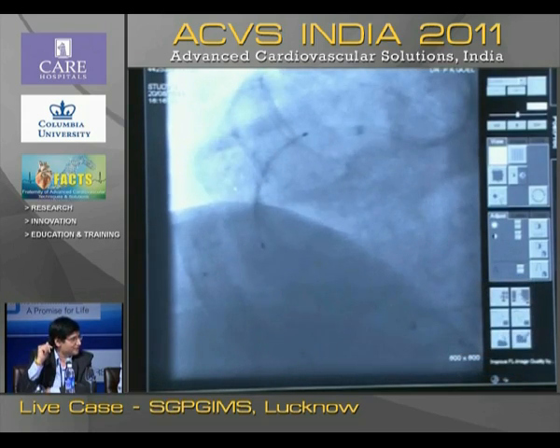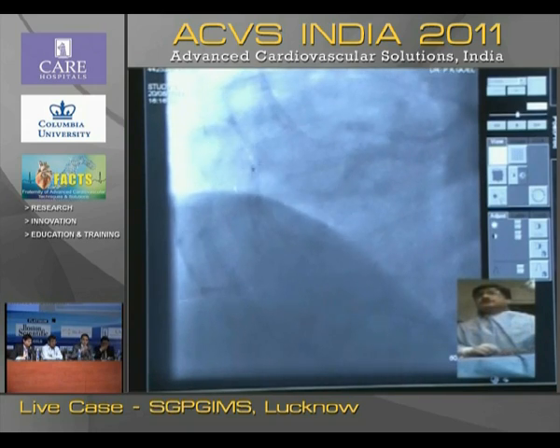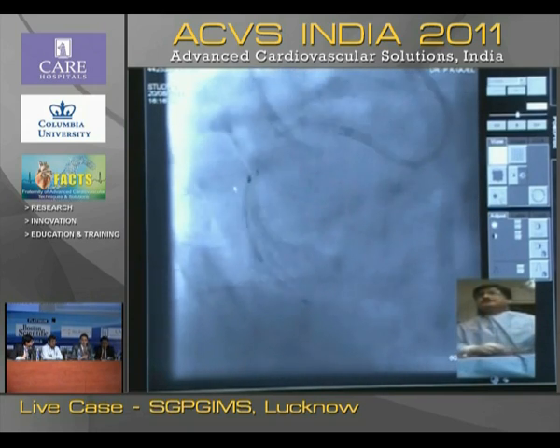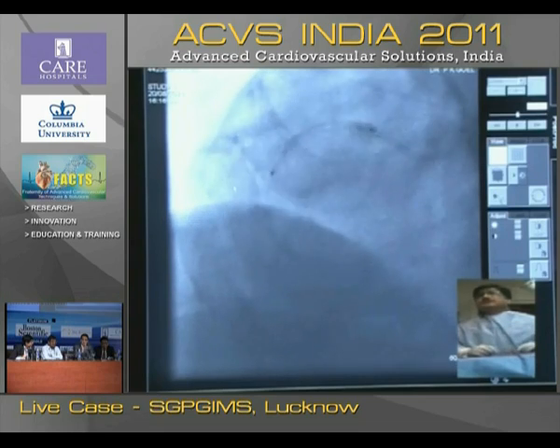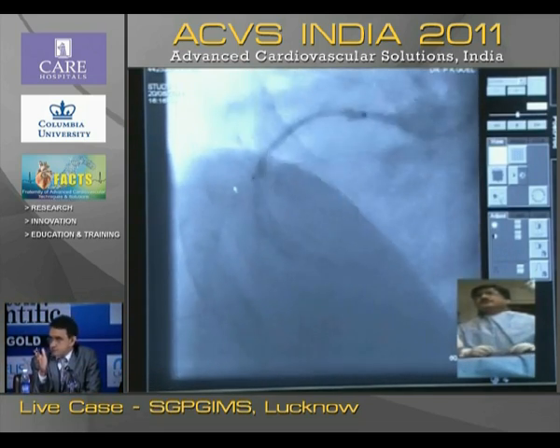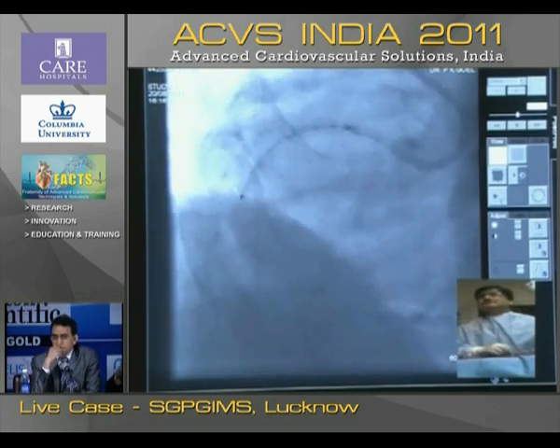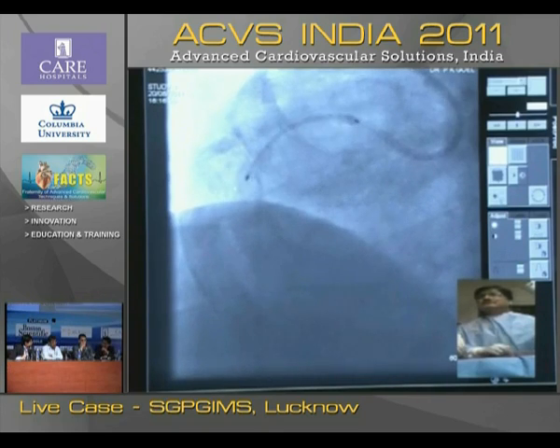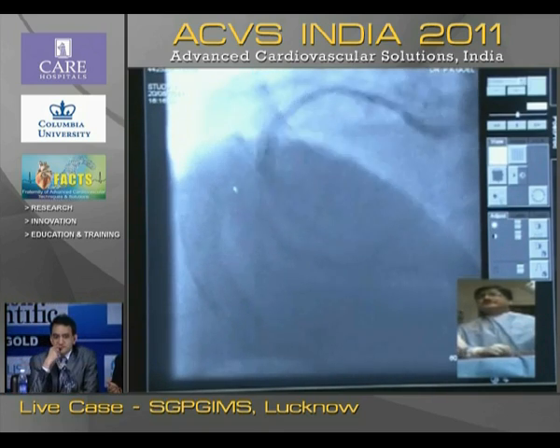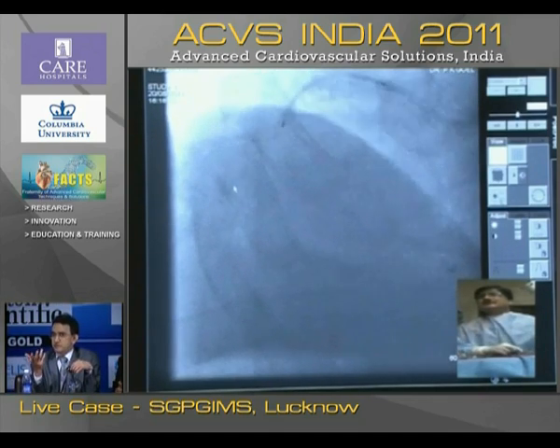Both have their own limitations. Sometimes a microcatheter just wouldn't go forward, while at the same time an OTW balloon would cross. I wouldn't say for every case you can use a microcatheter. The OTW balloon has a lower profile, that's its advantage. You can give a test shot in both of them, to check whether you are in the right lumen or not.